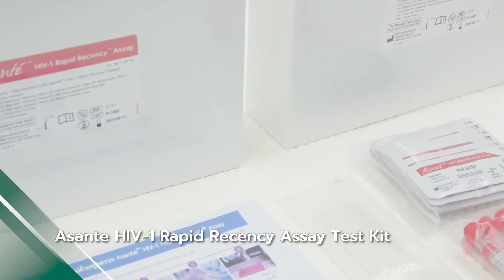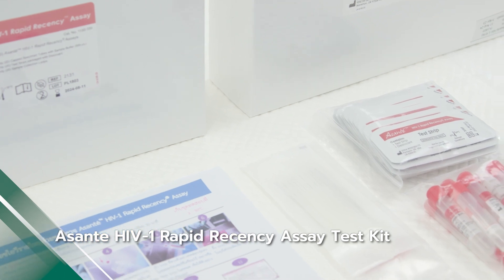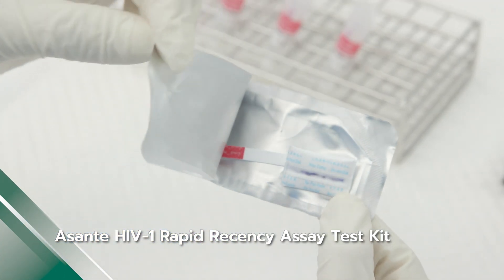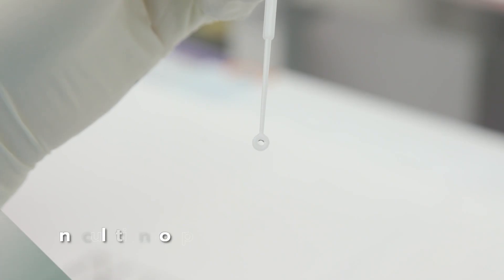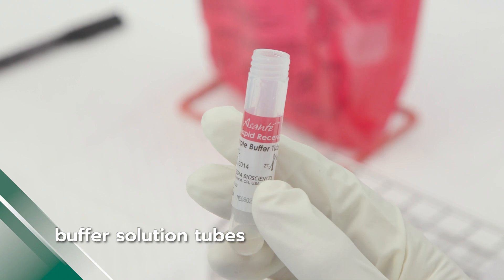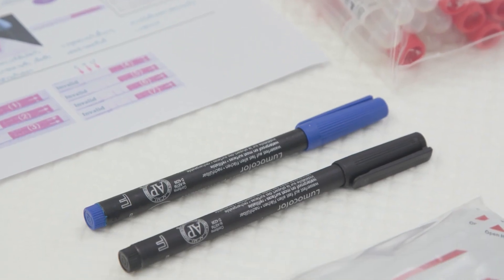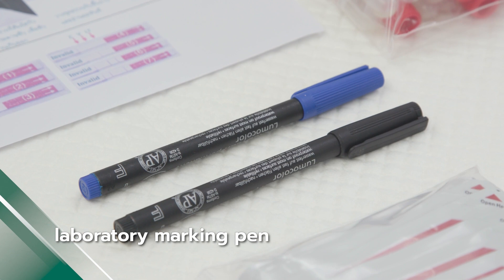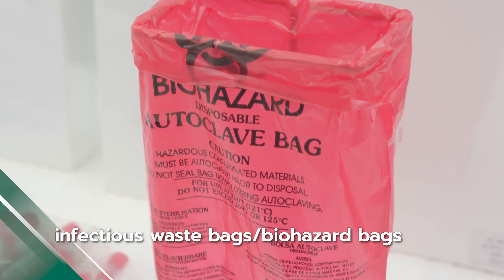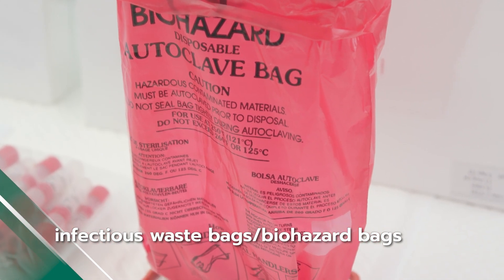The equipment used consists of the Asante HIV-1 Rapid Recency Assay Test Kit, in which each test strip is separately sealed, inoculation loops, and buffer solution tubes. Additional equipment includes a laboratory marking pen and timer.